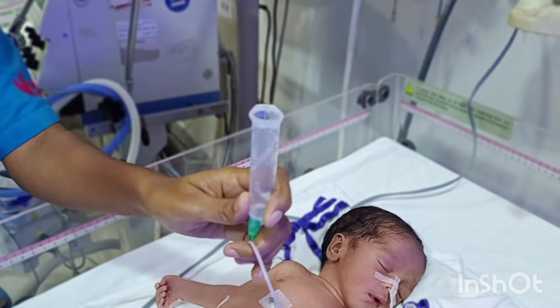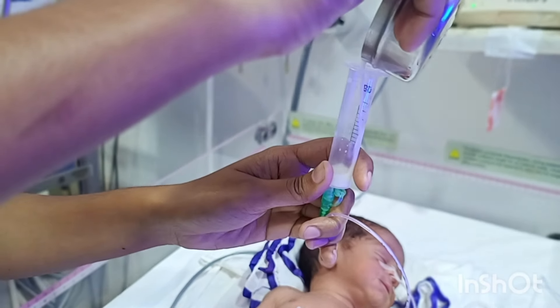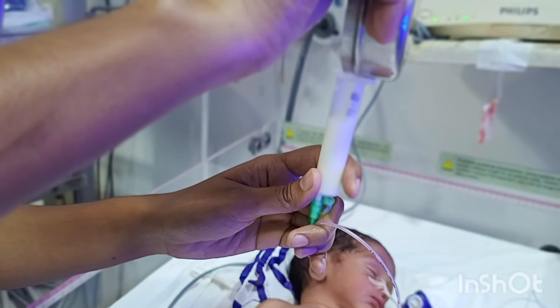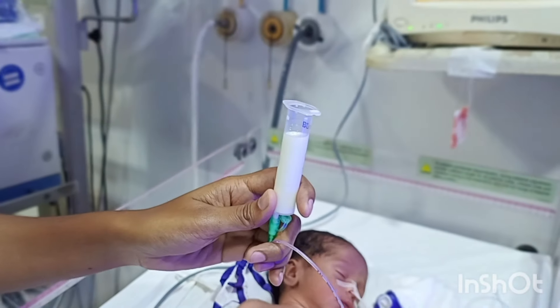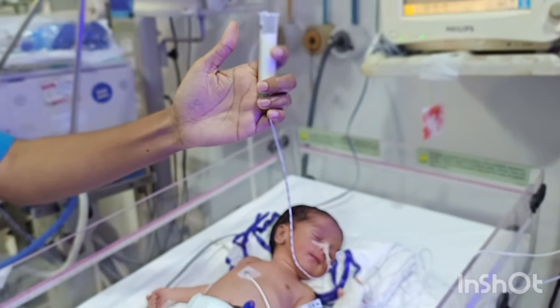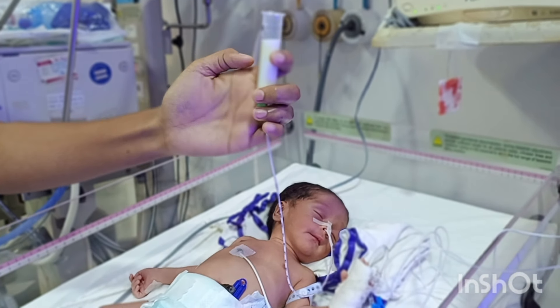The syringe volume may be 10 ml, 20 ml, or 50 ml, depending on the feed volume. Once the syringe is attached to the tube, we have to pour the milk inside the syringe. Here the baby is getting 10 ml of feed, so we have put the milk inside the syringe.